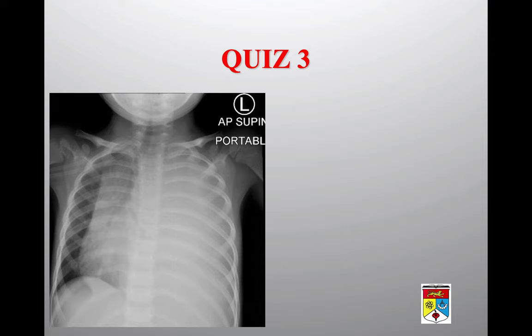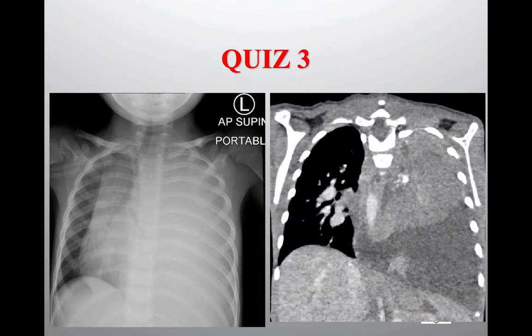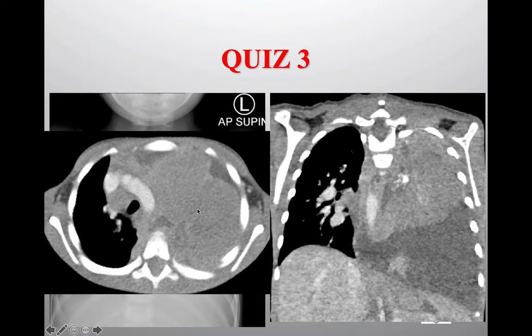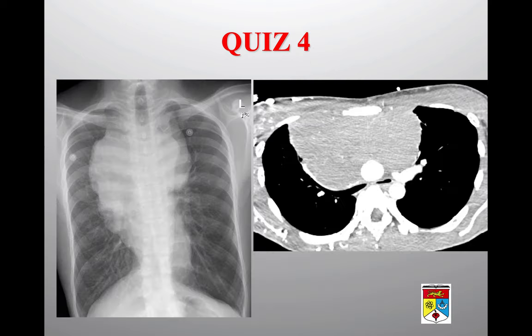Quiz 3: The abnormality appears homogeneously opaque — a unilateral opaque lung. The differential is empyema or a mediastinal mass. Ultrasound showed a solid lesion. CT scan — coronal and axial views — confirms a mass arising from the posterior mediastinum, compressing and displacing the mediastinal structures and the arch of the aorta to the right side. This is a thoracic neuroblastoma.